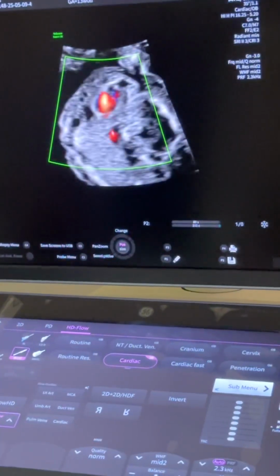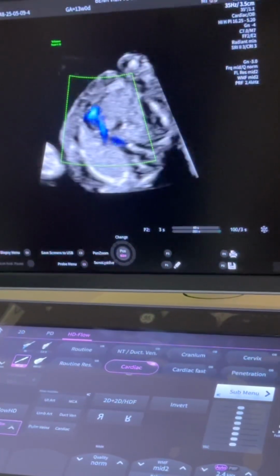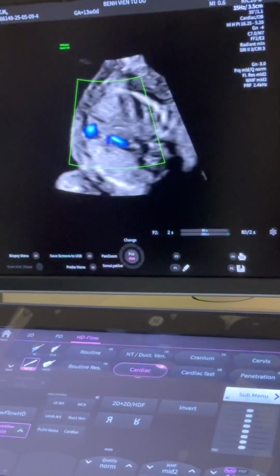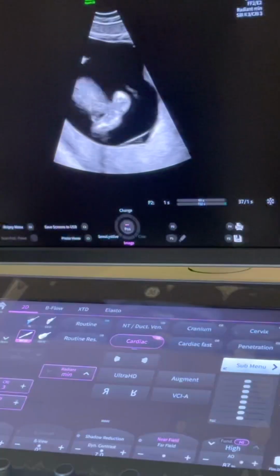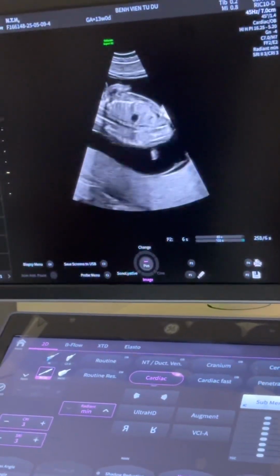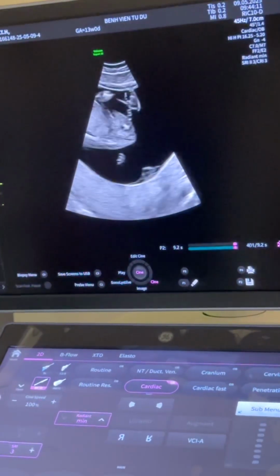And now I can see both cardiac chambers on the sweep. I'll be quick. So I can see both cardiac, just move. So when a baby does that and turns and moves on you, that's okay. Just go and do something else. So you remember when I was looking transabdominally, I could only see one kidney. If the baby's in a good position, catch it.